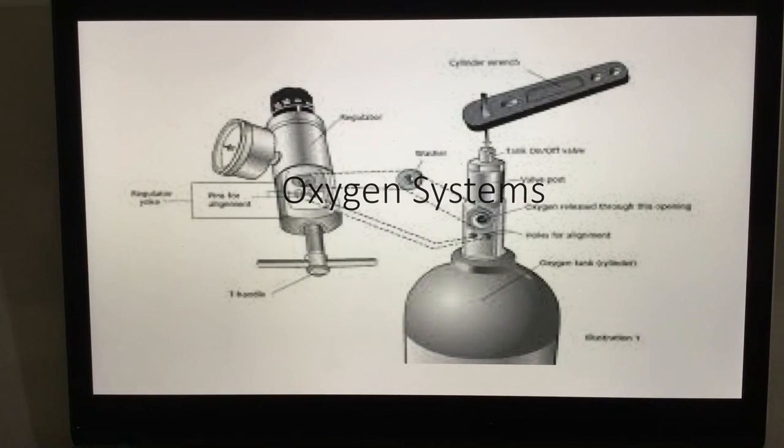Now coming off this regulator assembly towards the most distal port, you would have a flow meter. This flow meter regulates the volume and liters of oxygen being emitted out through that tank. It may start off at zero and move up in increments of 0.5, or may just start at 2, 4, 6, 8, 10, 12, 16, 18, 20, up to 25 liters per minute.